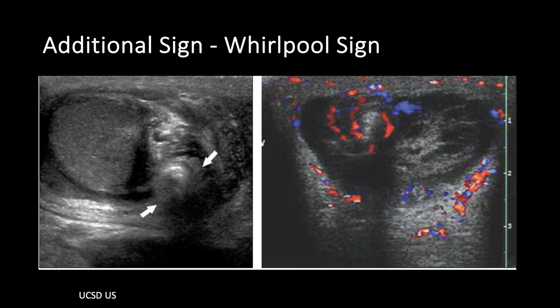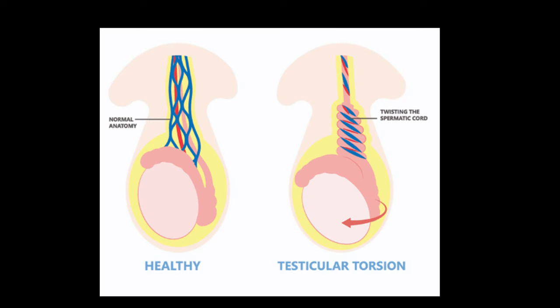Another sign to look for is the whirlpool sign — also called 'circling the drain' — which represents twisting of the spermatic cord and its vessels. With color Doppler it looks like a whirlpool; even on grayscale the twisted vessels have that characteristic appearance. This sign directly reflects the torsed anatomy of the arteries and veins within the spermatic cord.